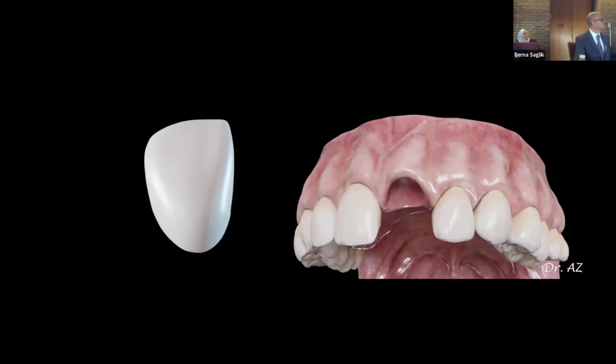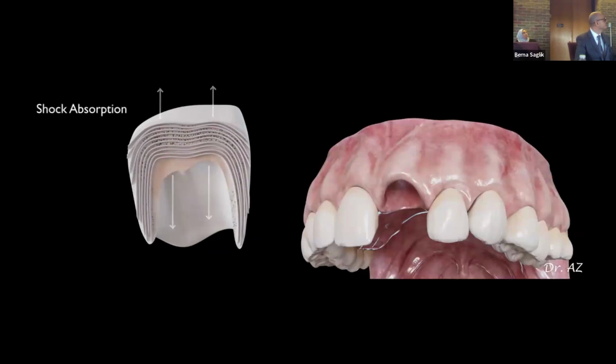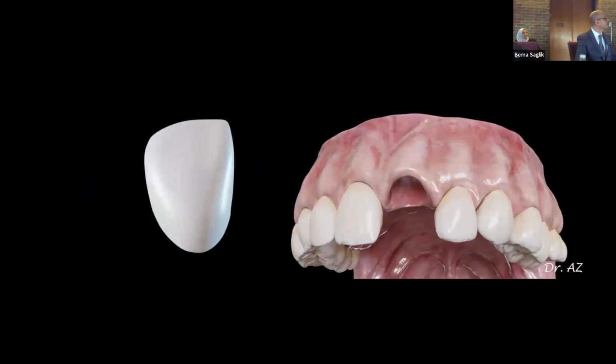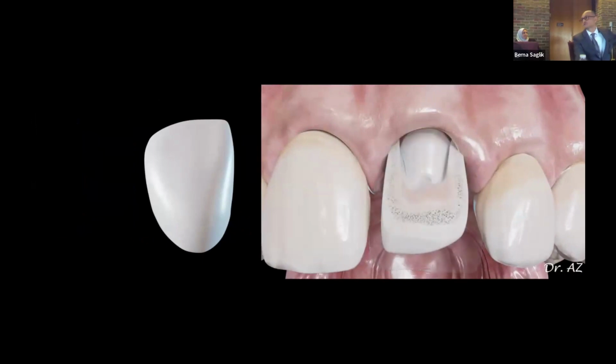So that was the concept that came with that idea. Basically, when you place it back there, it absorbs the shock. And if we can create it in all-ceramic, that may last longer as well, mostly on the implant, because the fracture rate of all-ceramic on the implant is higher. Again, rigidity, there's no PDL. That may help, but the question is whether it can be created.